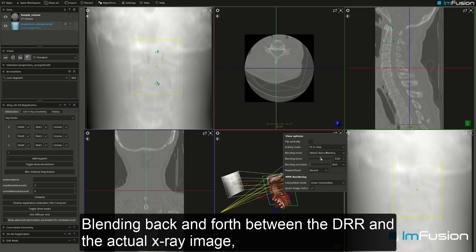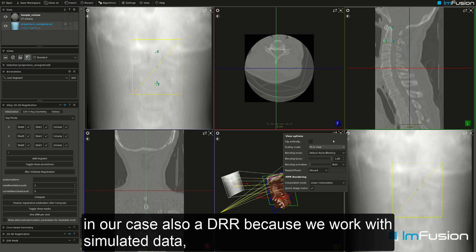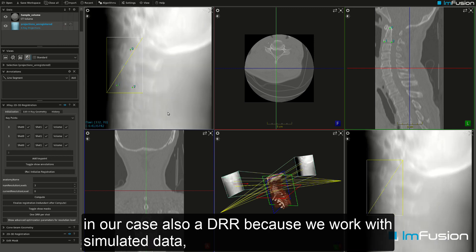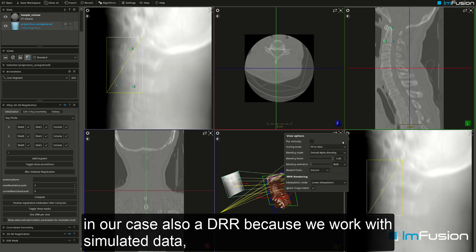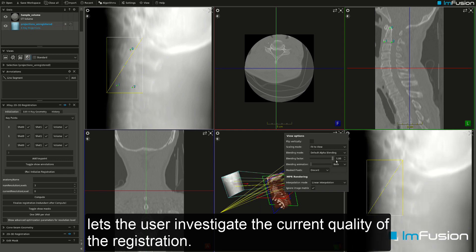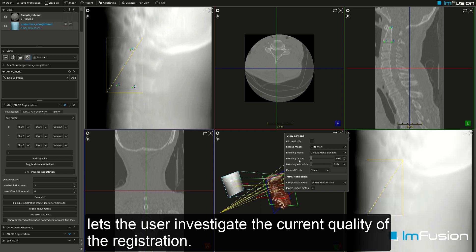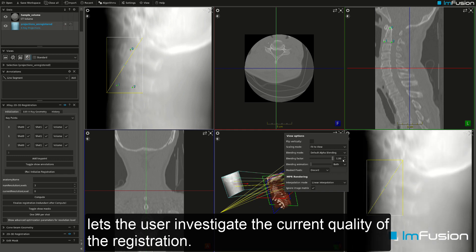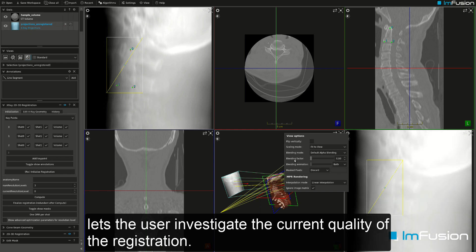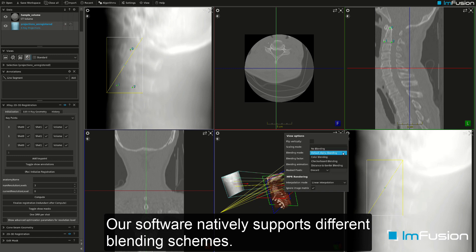Blending back and forth between the DRR and the actual x-ray image — in our case also a DRR because we work with simulated data — lets the user investigate the current quality of the registration. Our software natively supports different blending schemes.